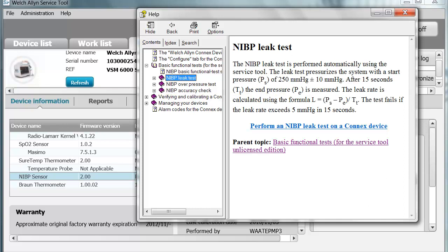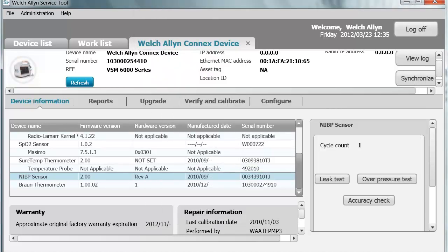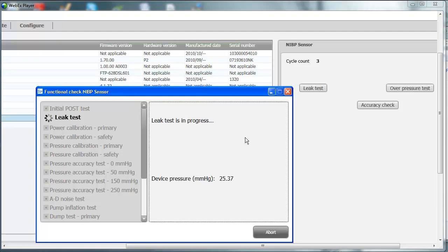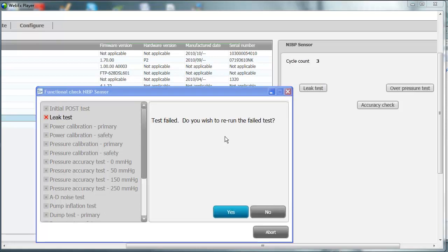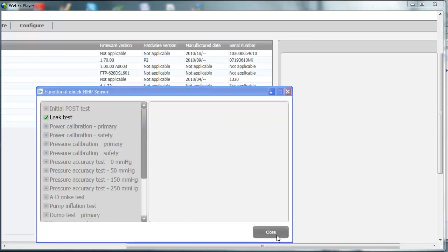If you click on the leak test, the help file tells you how to perform the test. Go to the Device Information tab, highlight the NIBP sensor, click the leak test, and follow the prompts. A pop-up tells you to connect to a 100 cc volume. Click Next and the test runs, testing the entire pneumatic system. This particular test failed — it put a red X next to the leak test because the tubing was not connected to the test volume. It asks if you want to rerun the test. Click Yes. After connecting to the 100 cc test volume, the leak test now has a green checkmark indicating it passed.